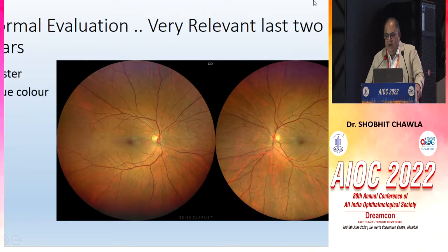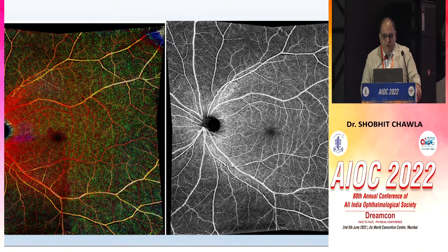Now, it was very relevant in the last 2 years, even for simple patient screening in the outpatient, when we were too afraid to come in close proximity to patients. We could just screen using a nice wide field color image and then do indirect ophthalmoscopy or more imaging as needed. So in diabetic eyes, we could avoid angiography and just do an en face surface OCTA and get an idea of the perfusion.